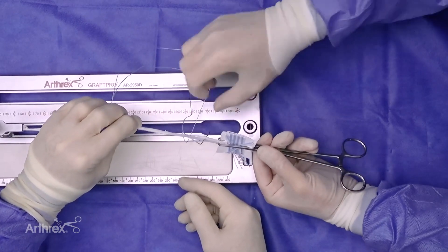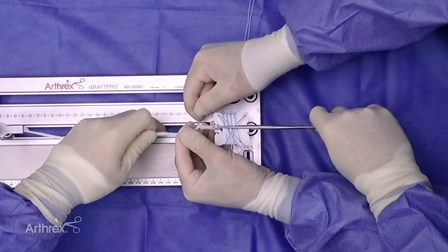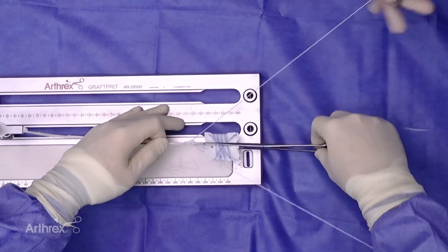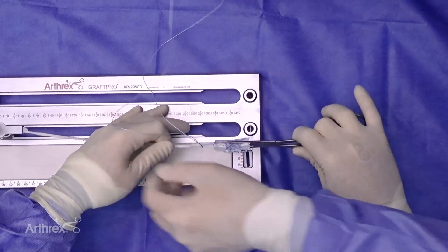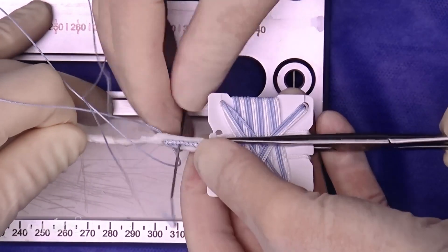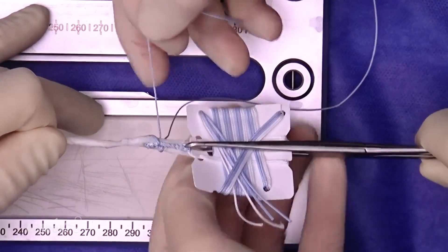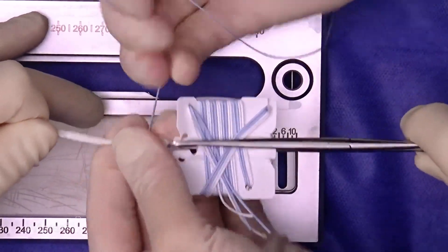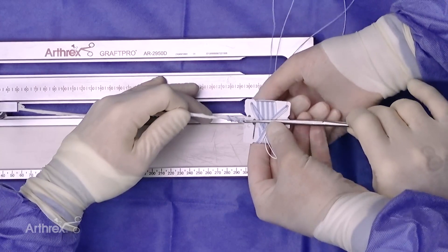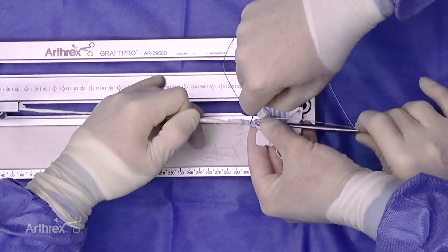The fiber tag is then laid down onto the graft and stitched into place. The fiber tag is initially stitched at the end to allow it to lay flush with the graft, and then a simple loop suture technique is utilized. The fiber tag is punctured approximately midway in the initial stitch. The loop is then sitting flush with the graft, allowing tubularization and security. Simple passage of the loop suture is then advanced to the level of the tightrope and fiber tag interface. The loop is secured, and the stitch is then passed through the hole in the actual tag, allowing suture to be placed through the tightrope, allowing additional security.